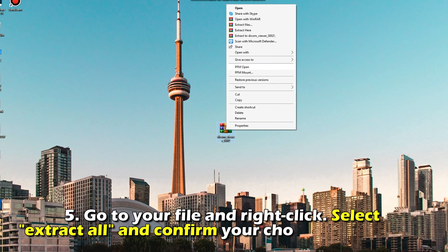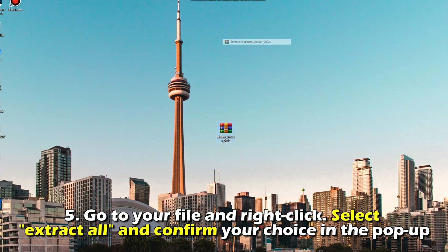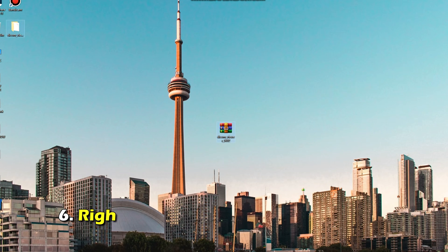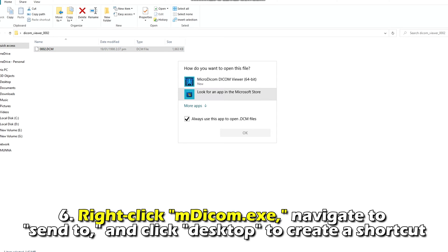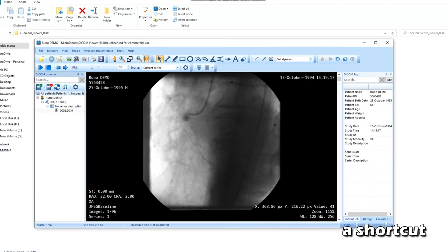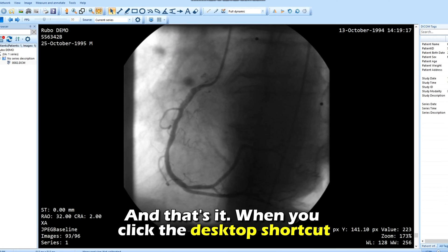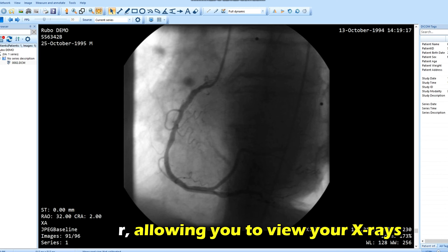Go to your file and right-click. Select Extract All and confirm your choice in the pop-up. Right-click mdicom.exe, navigate to Send To, and click Desktop to create a shortcut. And that's it — when you click the desktop shortcut, MicroDicom will run on your computer, allowing you to view your x-rays.